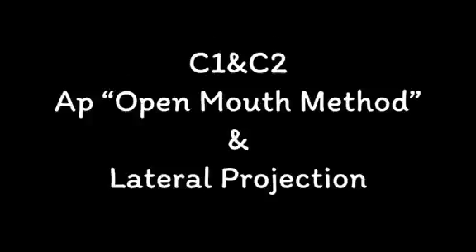In this video, I'm going to demonstrate the AP open mouth projection and lateral projection for the atlas and axis. The patient should be positioned erect in AP position. Unless trauma, the patient will be supine.